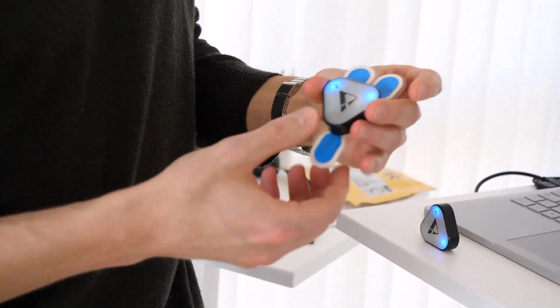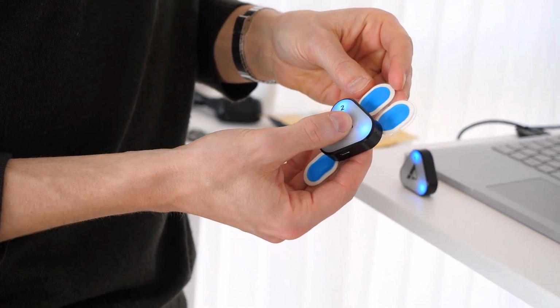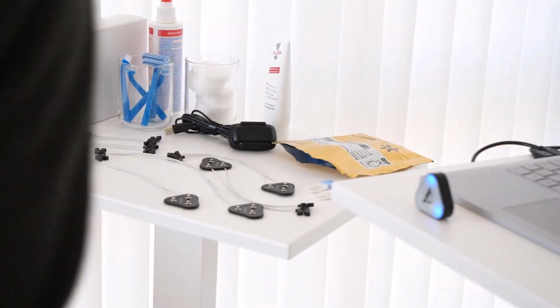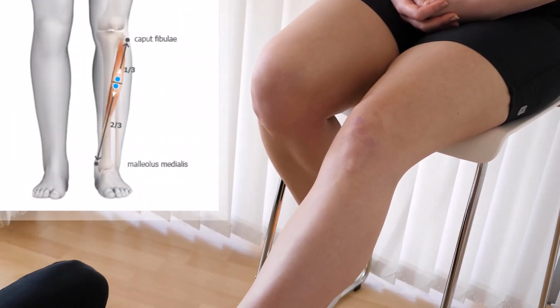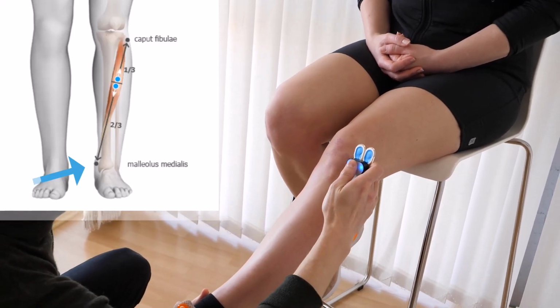The 2 electrodes that are on the lighted points of the sensor are placed in the direction of the muscle fiber. If we look at our example, we had already clarified that we are oriented to the medial malleolus and the fibular head. Here we should measure approximately 2/3 and 1/3 and then stick the electrodes in muscle fiber direction.